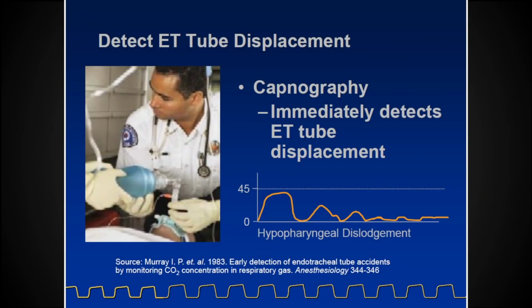Waveform can tell us a bunch of different things. You can find giant charts. It's funny, I'll look at a chart of all these different presentations of waveform and I'm like, cool, I've seen 3 of those in 15 years. So I would be a little careful here.